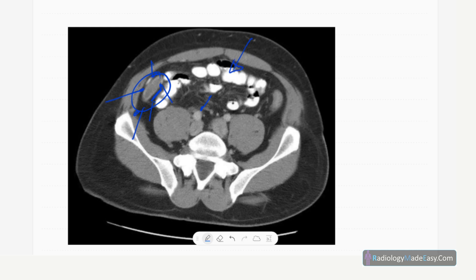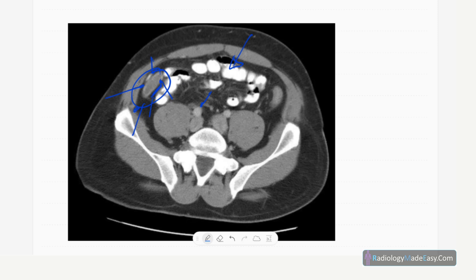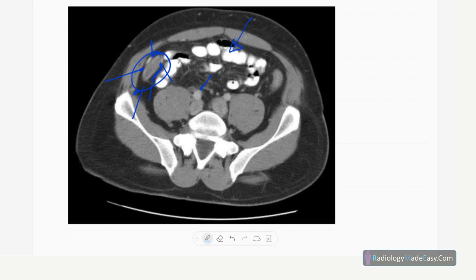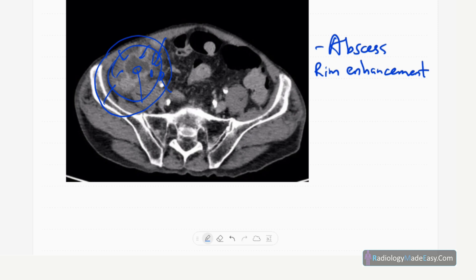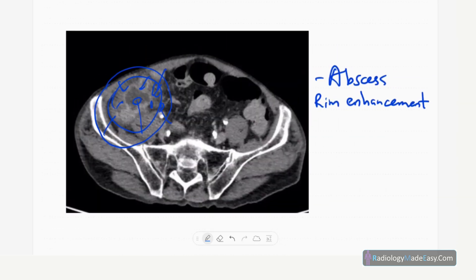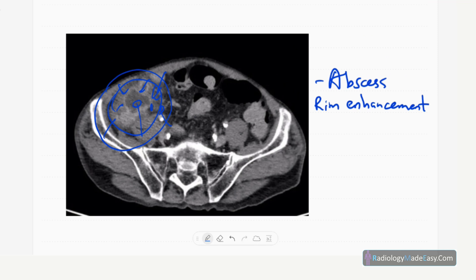On this contrast-enhanced axial CT image, you can see a rim-enhancing structure in the RIF region with low attenuation fluid inside — this represents an abscess in the RIF region due to perforation of the appendix. Surrounding fat stranding is also present in the region. This concludes our presentation on acute appendicitis in Radiology Made Easy.